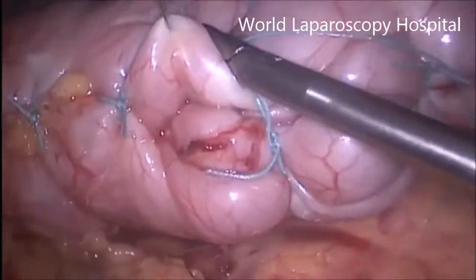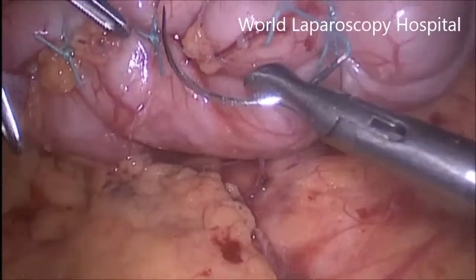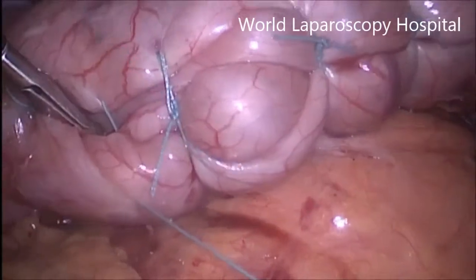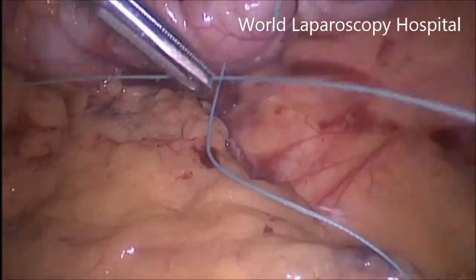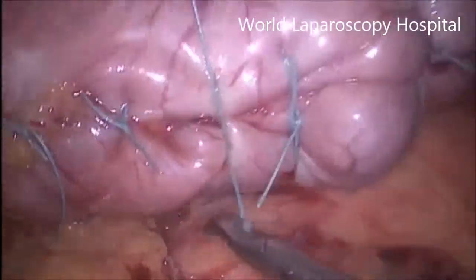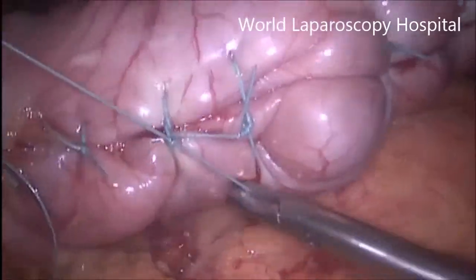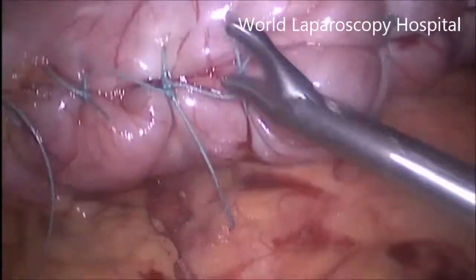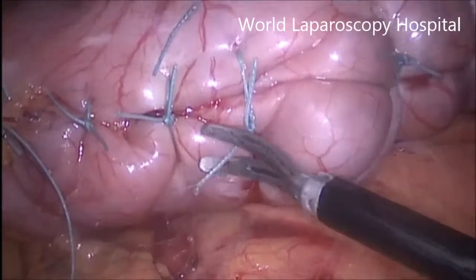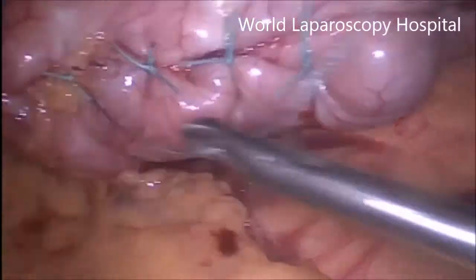Now in between, there is some gap and that has to be closed. That is important to prevent the herniation of the greater curvature. And this is the second row of the suture, which will be taken interrupted in between the plicated suture. All over it has to be taken to prevent one of the known complications. This interrupted suture has to be continued.